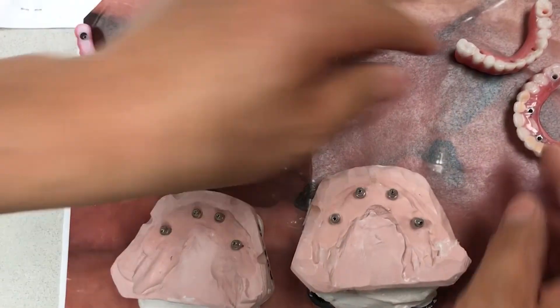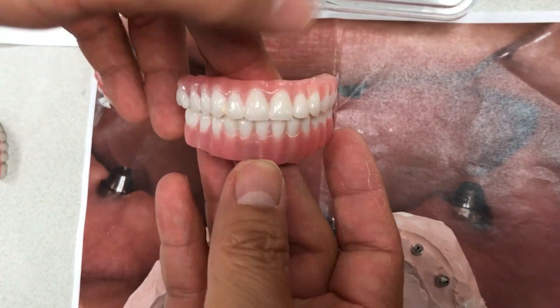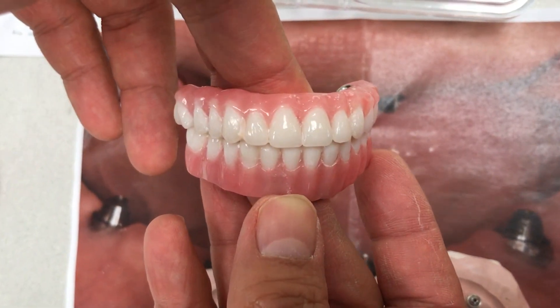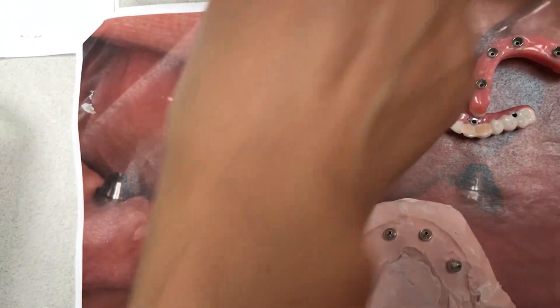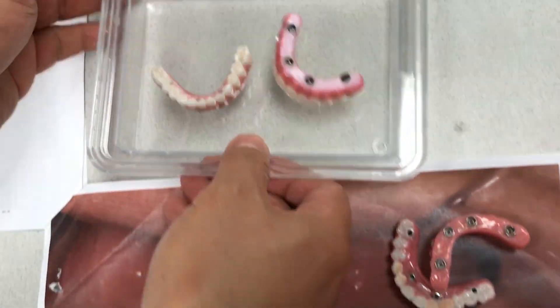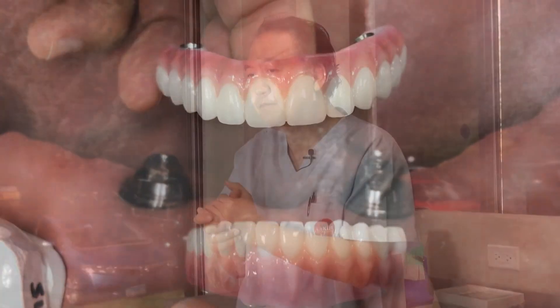Here are the polar types. We added a little more facial canine definition, and here is another sample. That one is the final result. There are a lot of technicians out there — you can choose basic work, mediocre work, or the highest quality work.